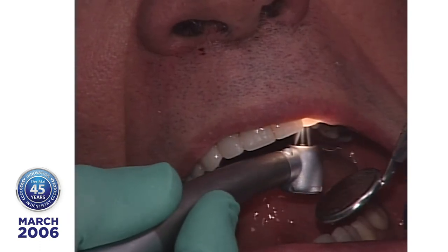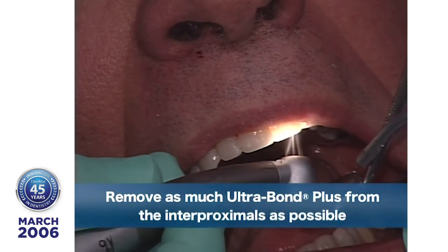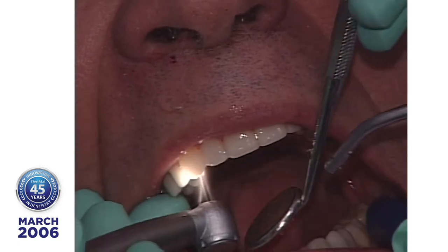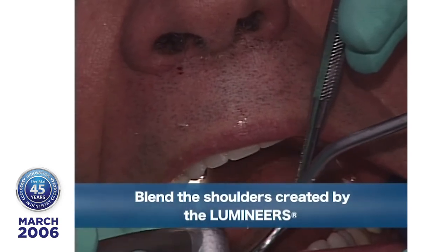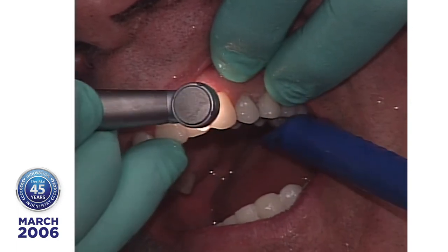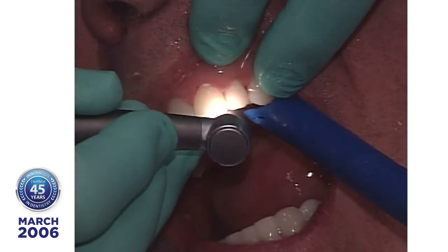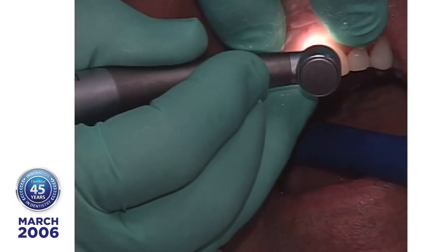And what I'm doing now is making sure I'm taking out as much of the Ultrabond from in between the contacts as possible. And now I know what I'm touching is porcelain. Why? Because I took out the Ultrabond. And then I can go into those interproximal embrasures. My objective now is to blend the shoulder that I've created. You see, if you haven't created a preparation, then you've created a shoulder right here. And I've got this magnification. I just follow the outline of the tooth, and I'm just getting those shoulders taken care of, defining the incisal edges so the teeth look distinctive.